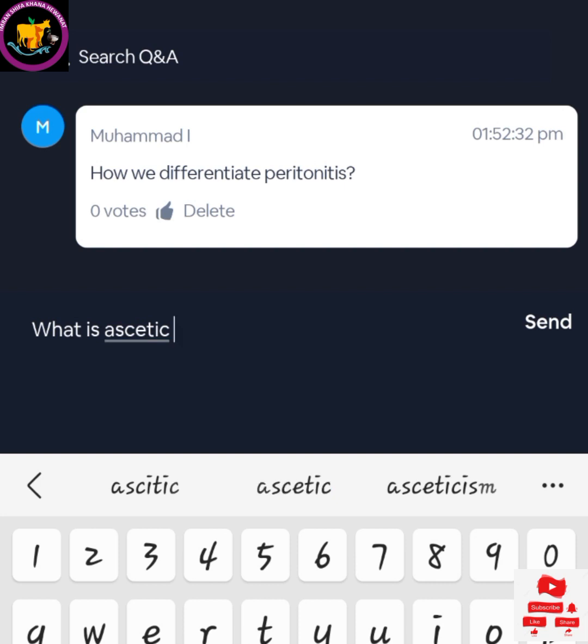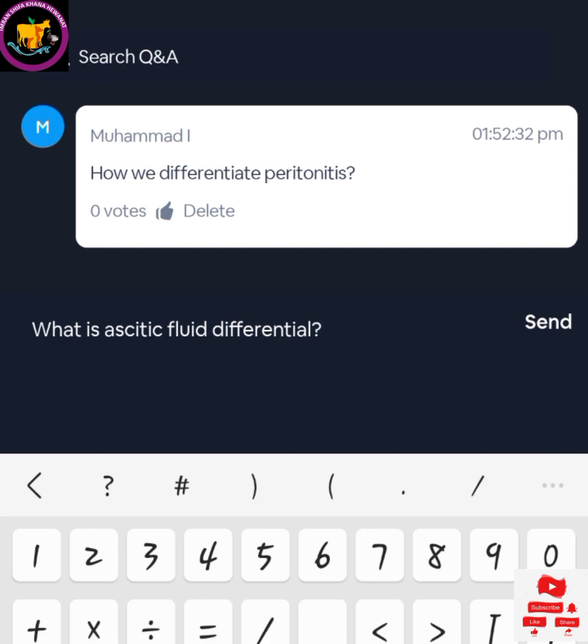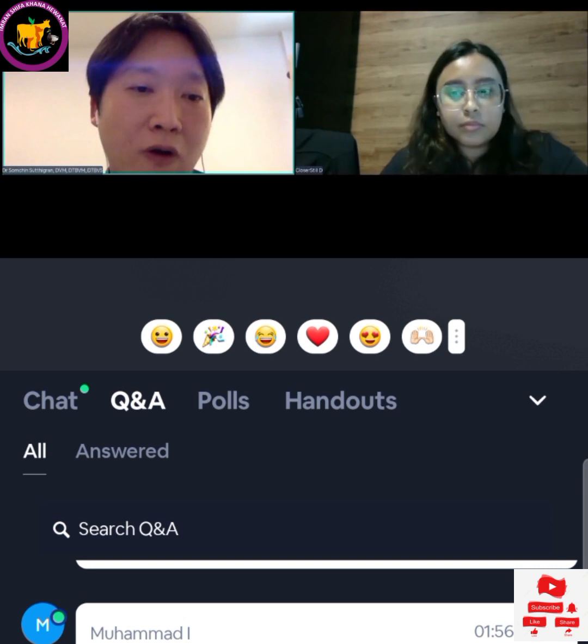In an emergency, you must use a technique. The first technique is to scan the full area of the abdomen, like the area of the urinary bladder and colon to see the fluid, and then move to the left kidney and spleen, and liver, hepatic and diaphragm. The kidney and the liver are used to detect small amounts. In some cases it's really small, a really small amount. You can put the dog in lateral recumbency, the left lateral, and you approach the probe to the left side, because the fluid will fall with gravity, and we will easily see it.